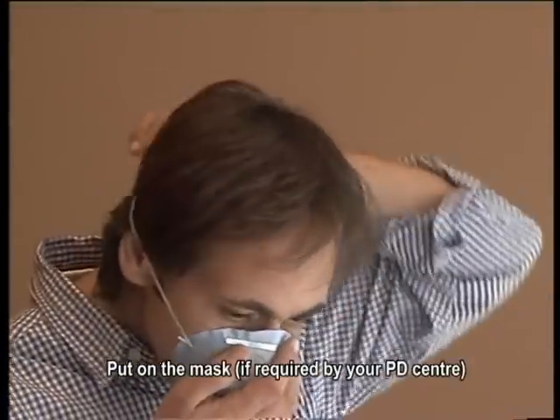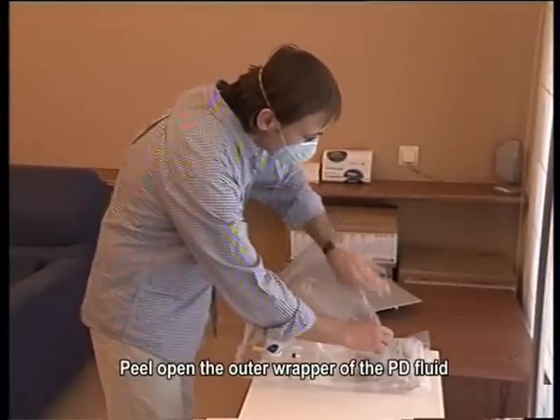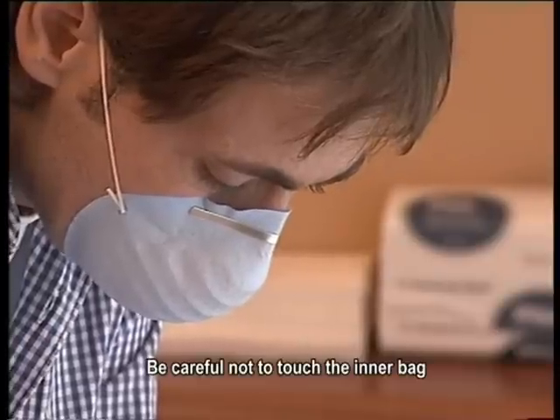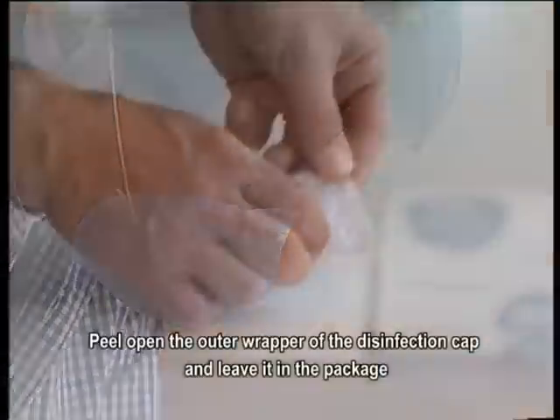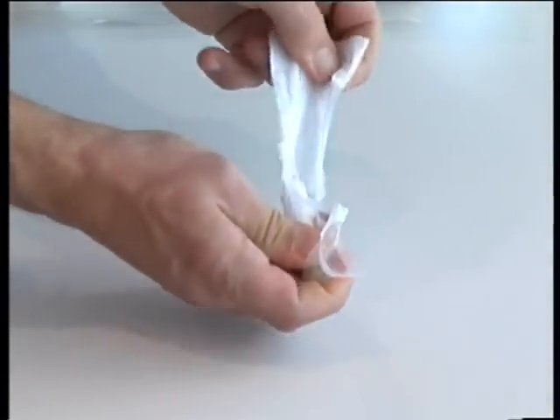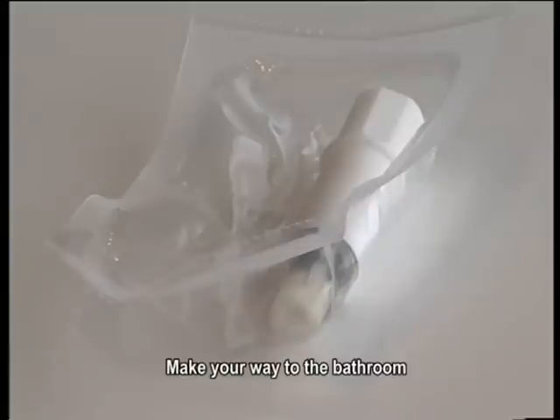Put on the mask, if required by your PD center. Peel open the outer wrapper of the PD fluid and leave it in the package. Be careful not to touch the inner bag. Peel open the outer wrapper of the disinfection cap and leave it in the package. Make your way to the bathroom.